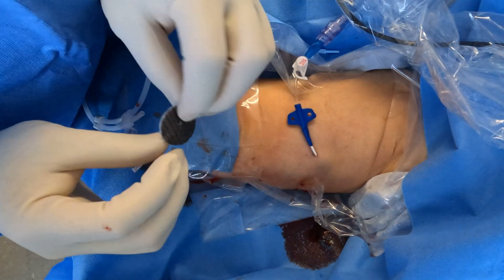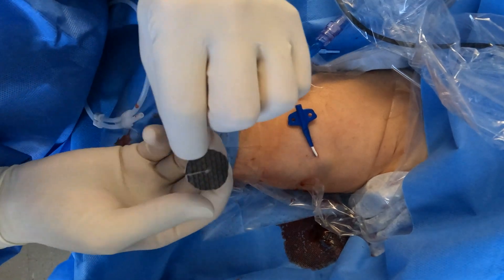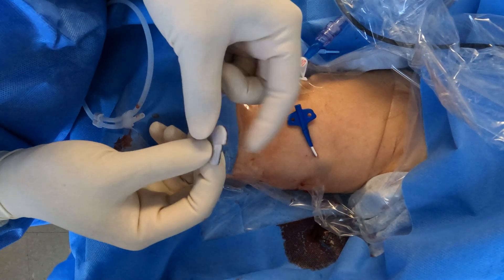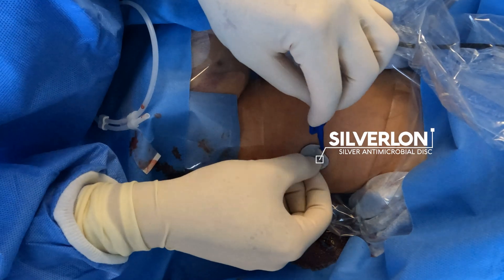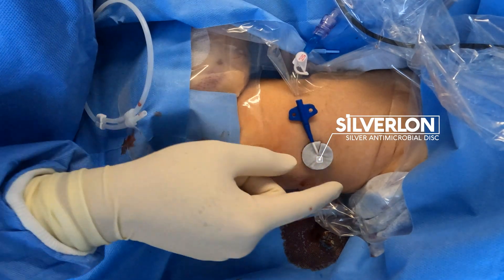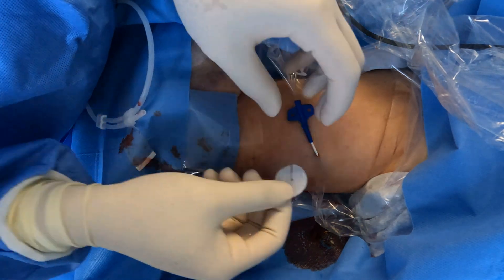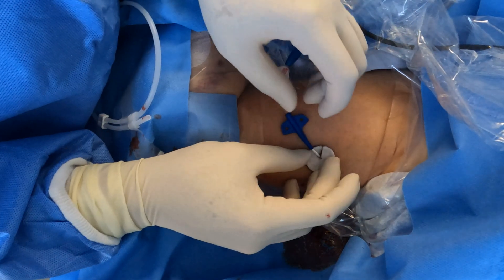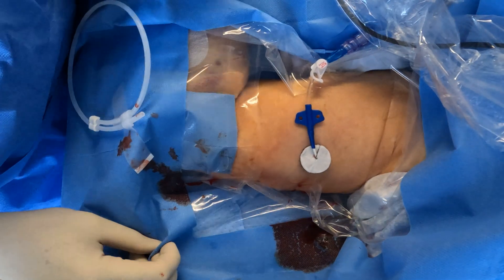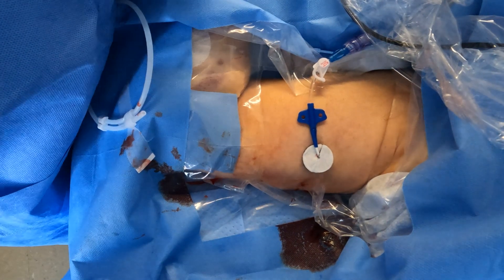This is a Silveron antimicrobial silver disc. This dark part needs to be on the skin — it needs to be facing the skin for it to be working. What I did before applying was put a few drops of saline. You want it to be soaked with saline so it activates the silver for its antimicrobial effect. It won't work as effectively when it's dry.